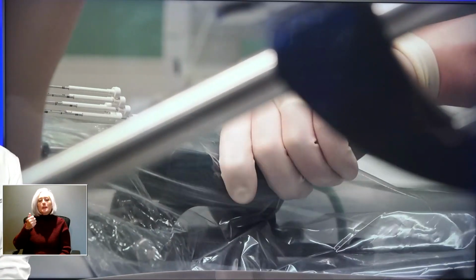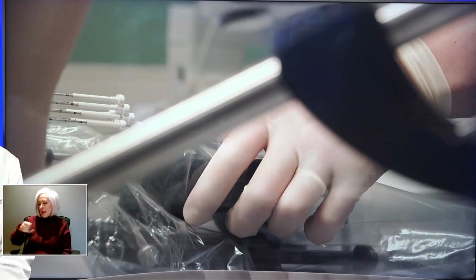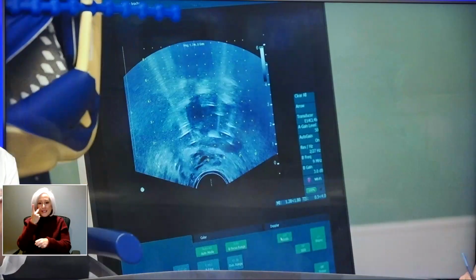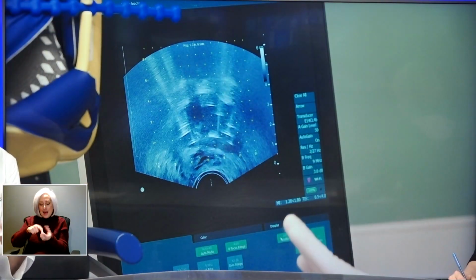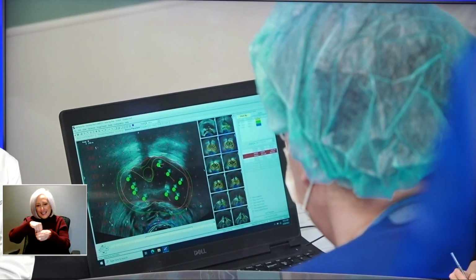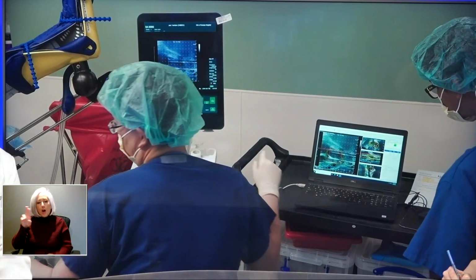How does that help? The brachytherapy really is a procedure that takes a lot of precision. We need to make sure that we're seeing the prostate very clearly, and I am putting seeds very precisely in different locations throughout the prostate. And using the ultrasound, a very sophisticated ultrasound, allows us to see the prostate as accurately as possible so I can put the seeds where they need to go.